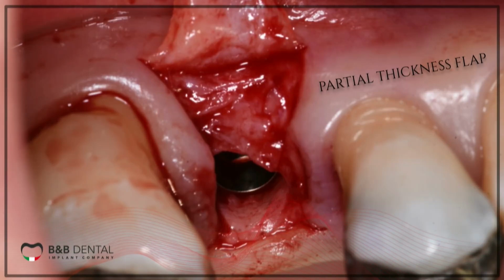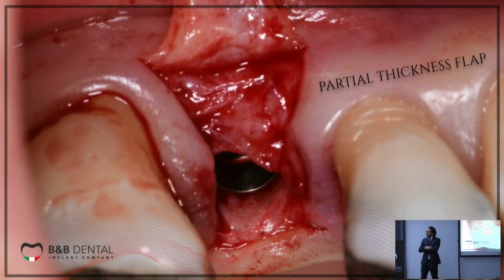One important thing that I use during these surgeries is also the partial thickness flap or the flapless approach.